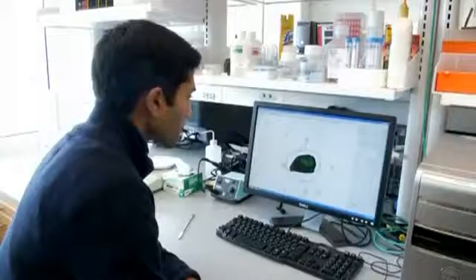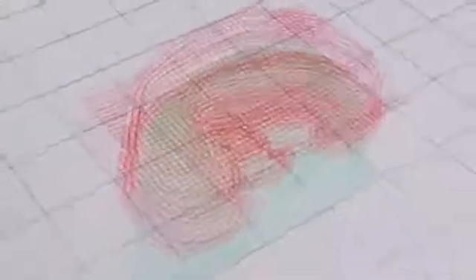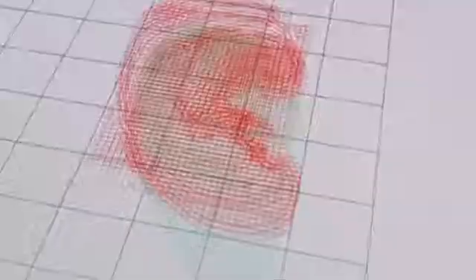To achieve the precise ear shape, technicians used 3D panoramic photographs and laser scans capturing the geometry of the patient's other ear, and then fed the data into a computer that translated it into a lifelike implant. The whole idea behind this is we simply don't want to put an artificial material in the body. We want to replace ear cartilage that's absent or has been destroyed with new cartilage. And that's essentially what this tissue engineering technology does.